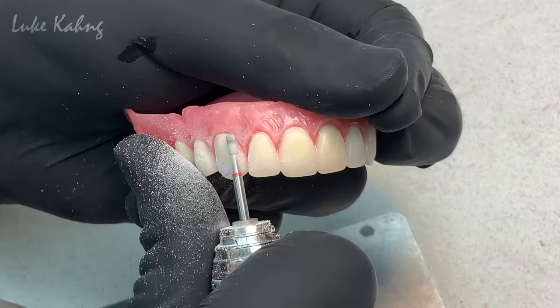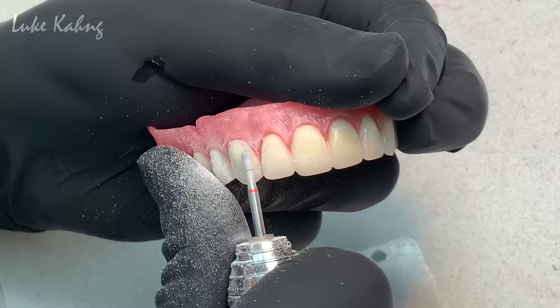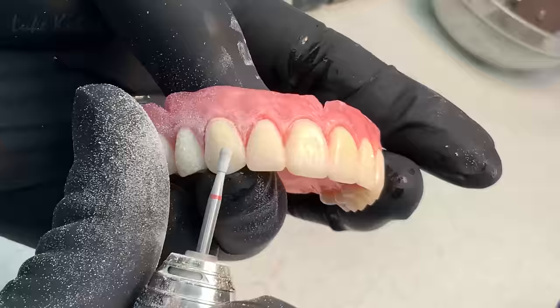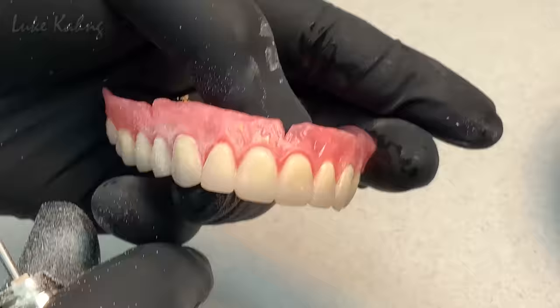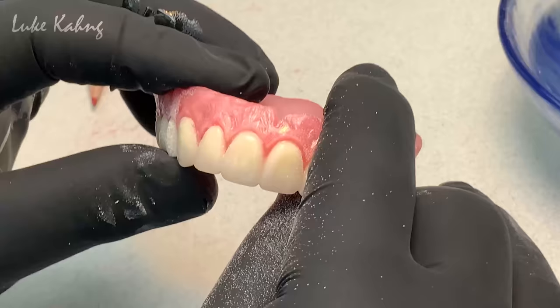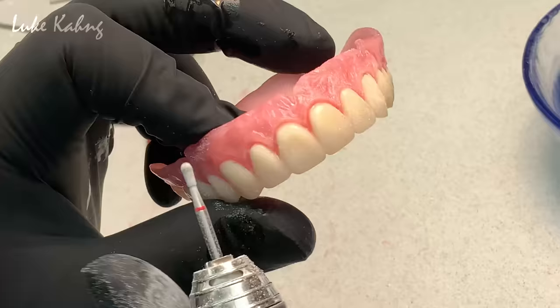You see? Not a lot. Right? So. Okay. Now, this one. With the carbide bar, start using the water, you see? That's it. Now we can clean it, then we can try.